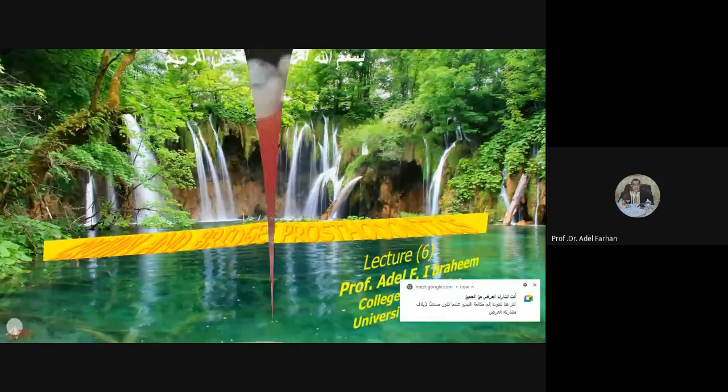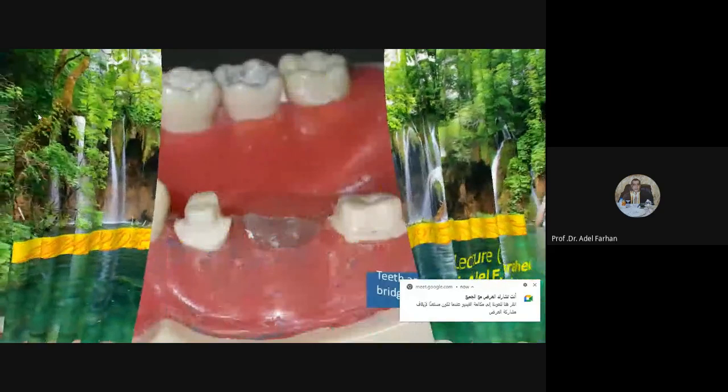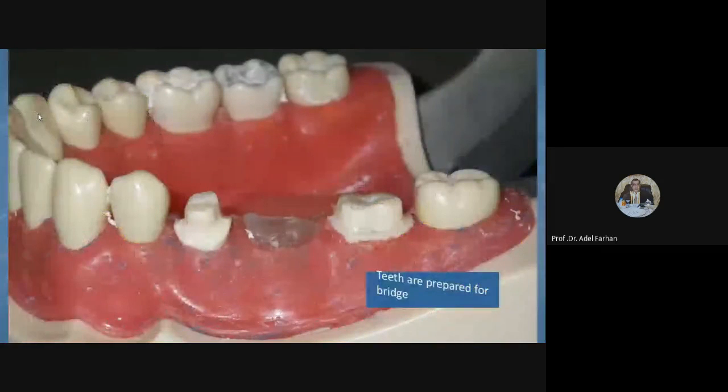محاضرتنا اليوم راح تكون المحاضرة السادسة مثل ما تكلمنا الأسبوع اللي فات. طبعا أغلبها اليوم راح تكون كلينيكال وتكملة للمحاضرة السابقة اللي تكلمنا بها على السوفت tissue management about retraction, gingival retraction. Today, after we complete retraction, next step is, after you prepare teeth and now you do retraction, now you are waiting for impression، اللي هي طبعا الفاينل امبريشن اللي راح ناخذها الان.